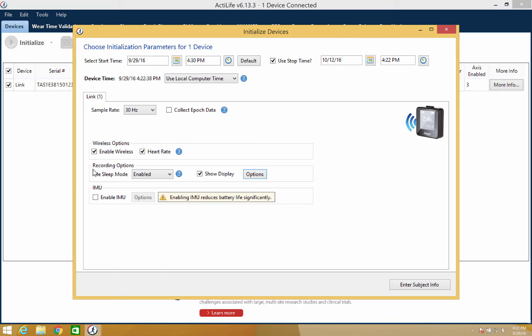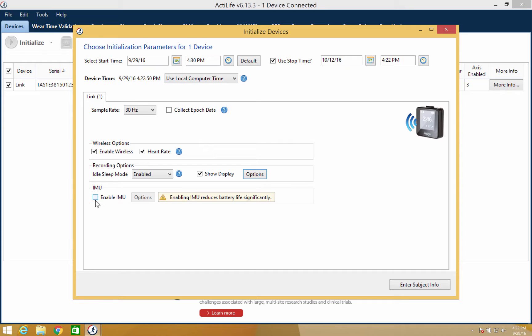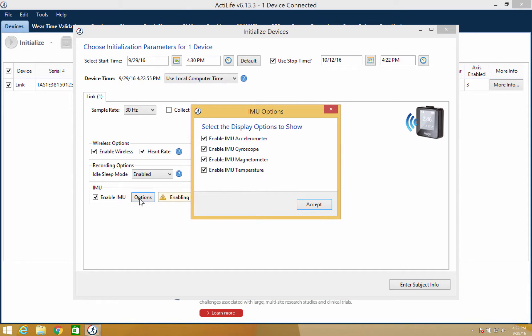The GT9X link also contains an IMU sensor, which can be turned on or off. Note that activation of the IMU sensor will dramatically reduce the battery life. When the IMU sensor is turned on, you can then select options and a new floating window will appear.